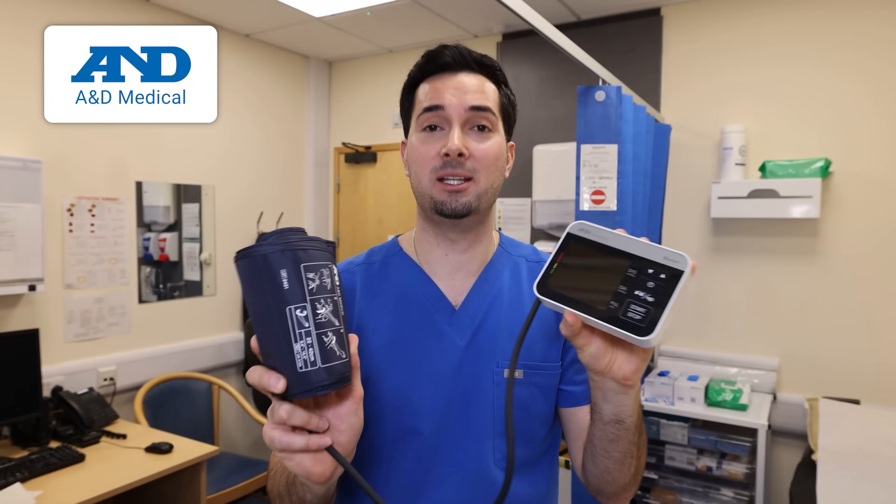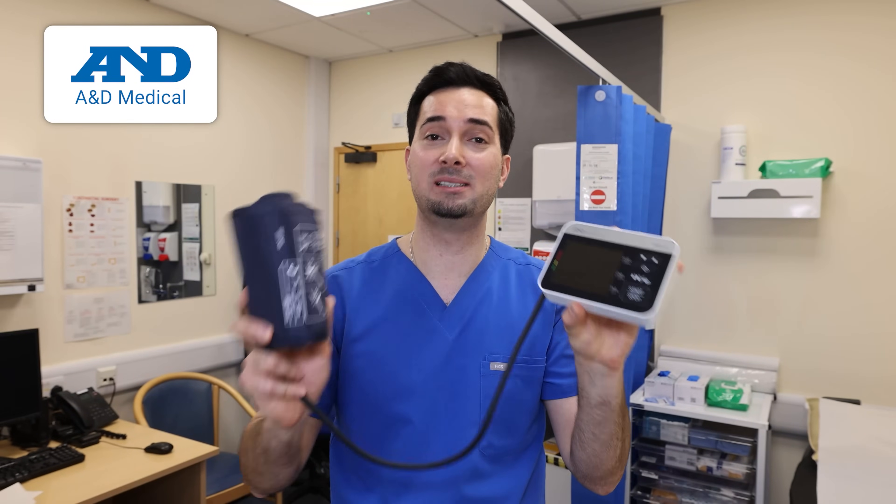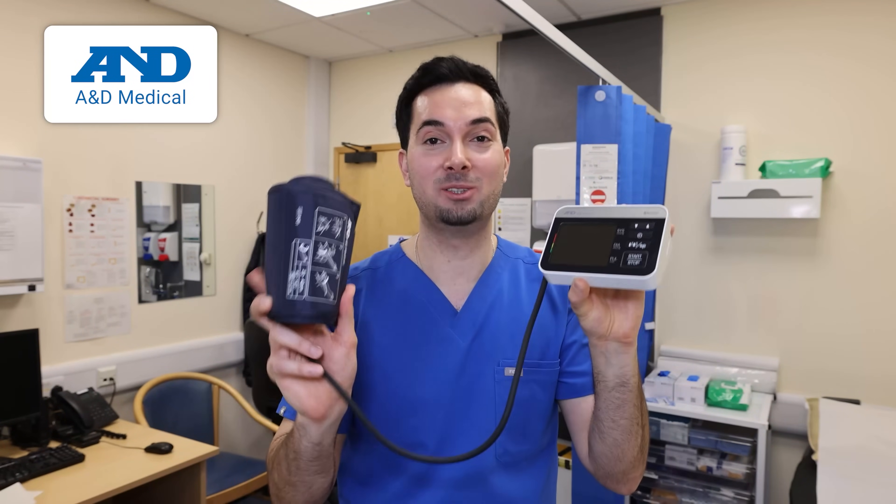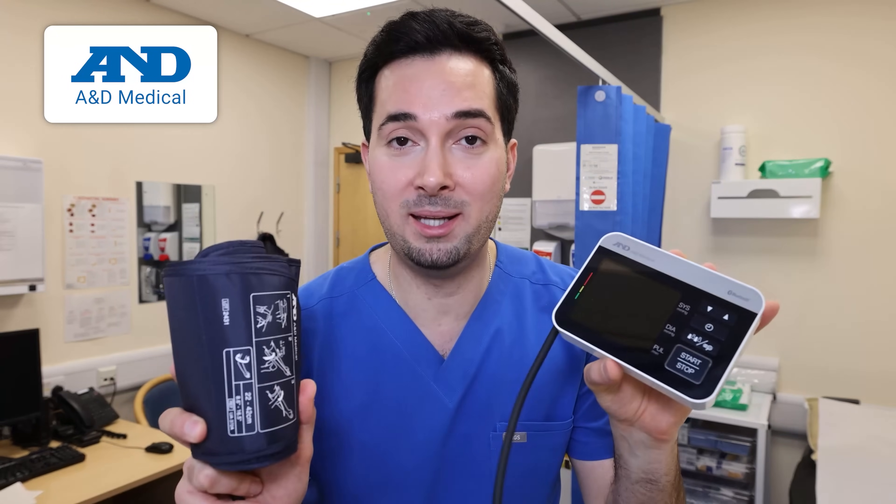Here's my pro tip: make sure the blood pressure monitor you use at home is clinically validated for accuracy and on the Validated Device List — the VDL — recognized by the American Medical Association, Hypertension Canada, and the British and Irish Society of Hypertension. Many monitors on Amazon are not on this list and are not accurate. I've personally used A&D Medical's blood pressure monitors in my own practice for years — they're a workhorse and clinically validated, and as the inventors of the digital home blood pressure monitor in 1977, they definitely know what they're doing.